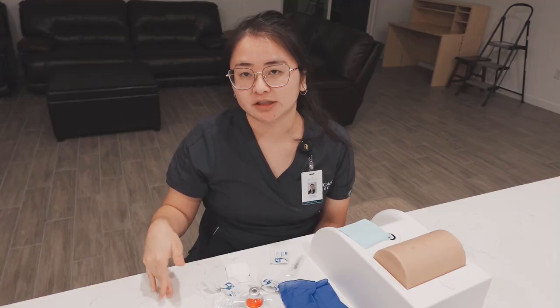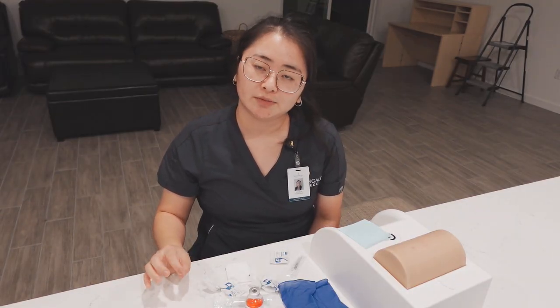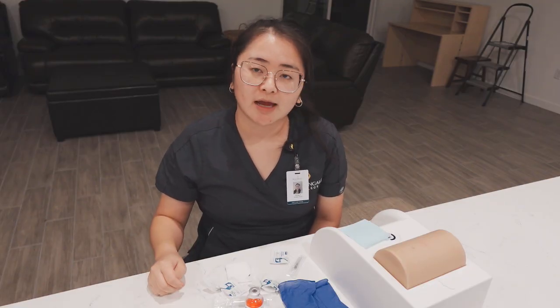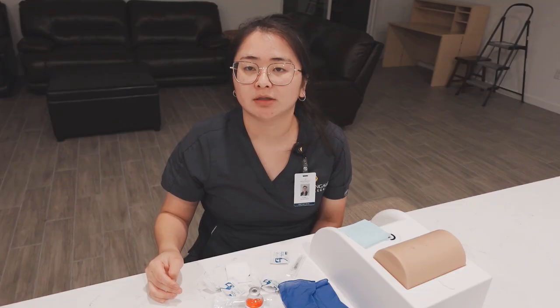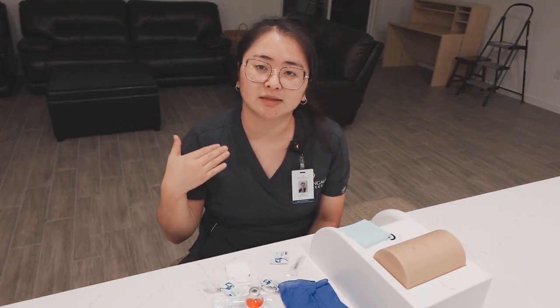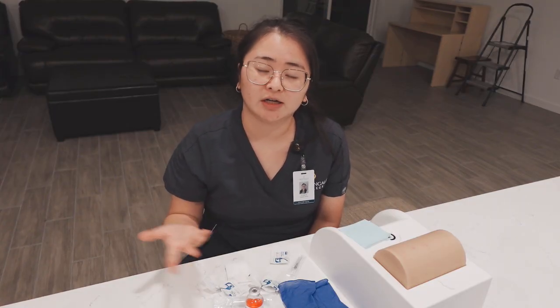For this particular injection, we would need a 22 to 25 gauge, and it would need to be 1 to 1.5 inches for the needle. And for the syringe, it needs to be 3 milliliters. Also, if you see my video becoming blurry here and there, that's just because the camera is trying to focus on me, but I did not edit the video in any way, shape, or form.